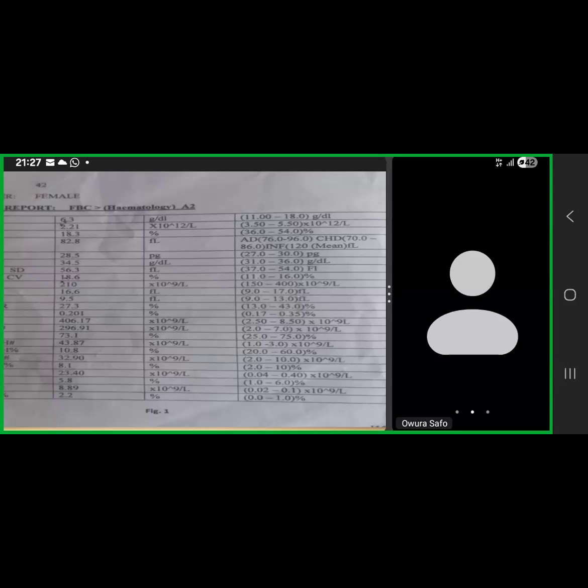Why did you choose to talk only about neutrophils and lymphocytes when there is basophilia and then there's eosinophilia, and also monocytosis? Why have you decided that they don't matter?